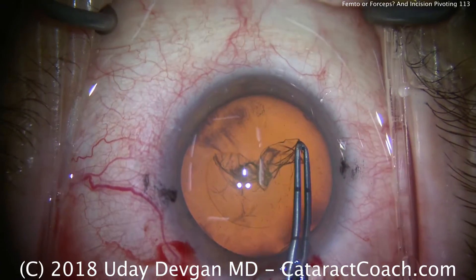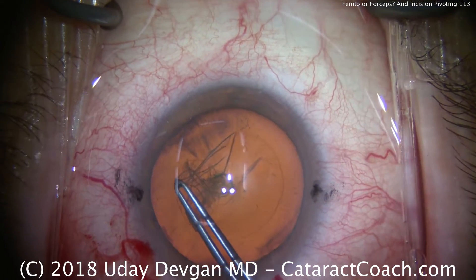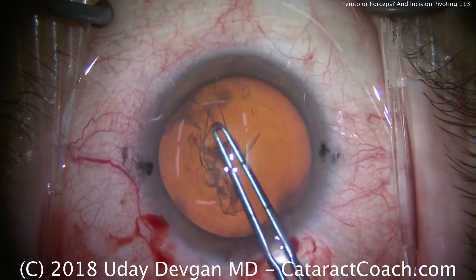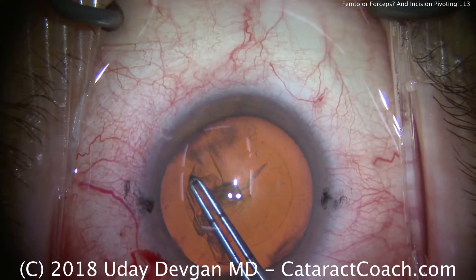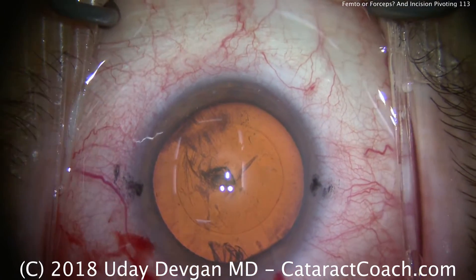By floating in the incision, we maintain the viscoelastic fill, keep the anterior lens capsule flat, and make the capsulorrhexis far more predictable. Just like that — and that's a pretty darn round capsulorrhexis.